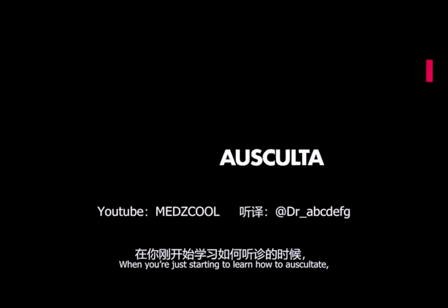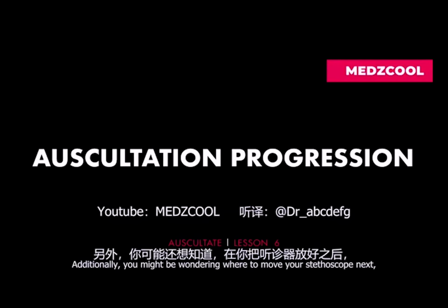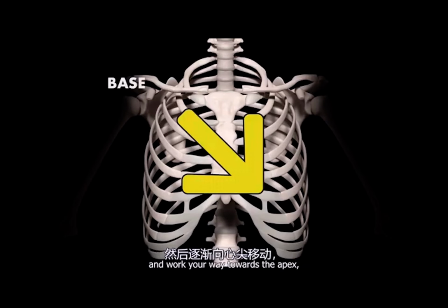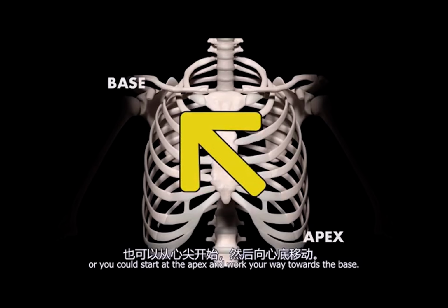When you're just starting to learn how to auscultate, you might be wondering where you should place your stethoscope. Additionally, you might be wondering where to move your stethoscope next, after you first place it on your listening surface. These are both important questions, but luckily the answer is simple. You could start either at the base of the heart and work your way towards the apex, or you could start at the apex and work your way towards the base.